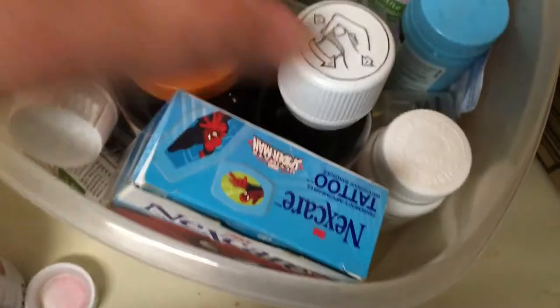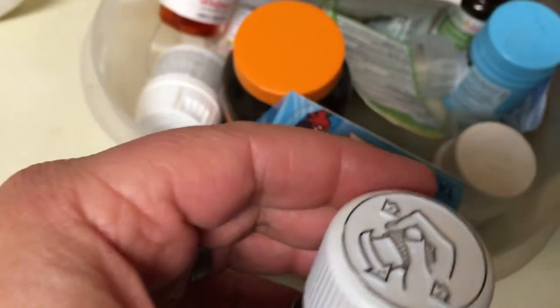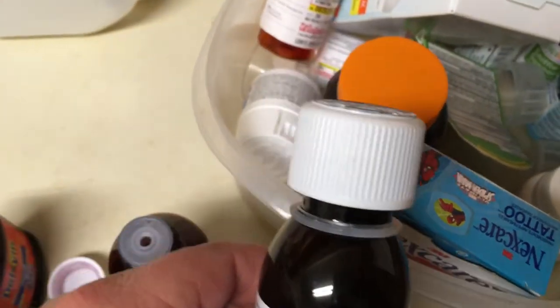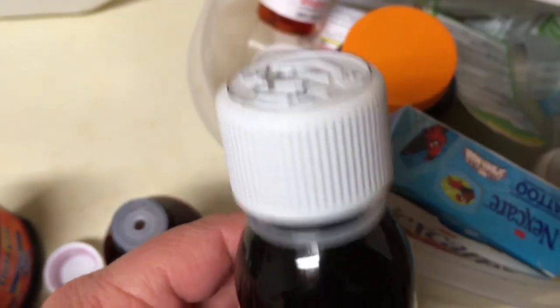And this Mucinex bottle, as you can see, the lid is super big and the opening is really big. So I don't know if they make an adapter for this size bottle, but it's a pretty good size bigger — maybe like a 45. I don't even know if they make those that size, but it would not fit here either.